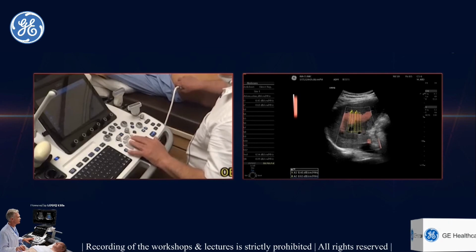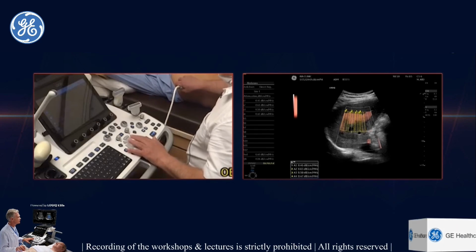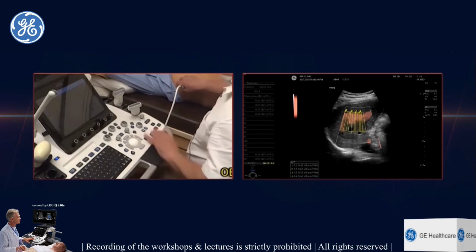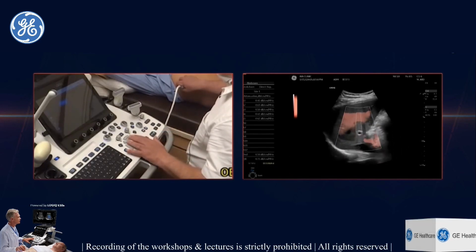And just in a flash of a minute, we take multiple measurements of the attenuation parameter of the liver, and it can tell us what exactly is the liver fat estimation. So the same segments are taken essentially all the time.